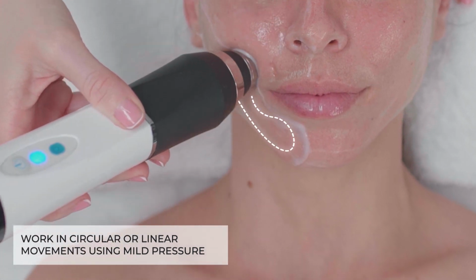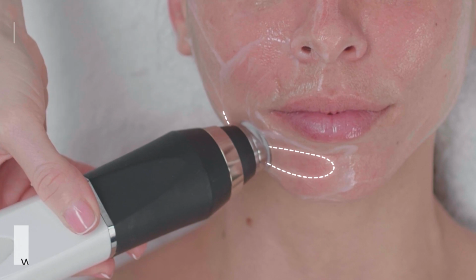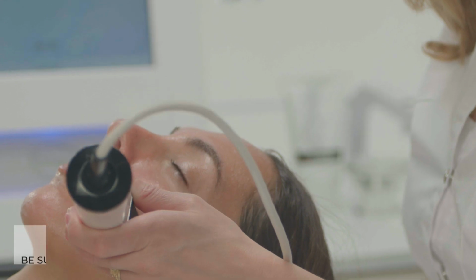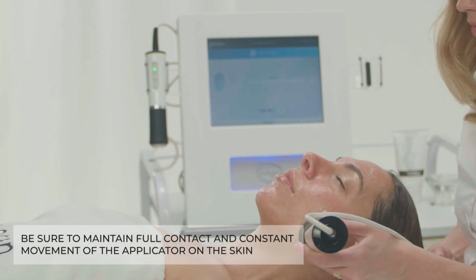Work in circular or linear movements, using mild pressure over the entire area. Avoid contact with eyes and mouth. Be sure to maintain full contact and constant movement of the applicator on the skin.